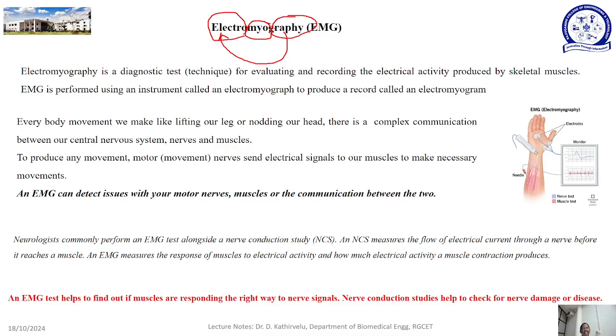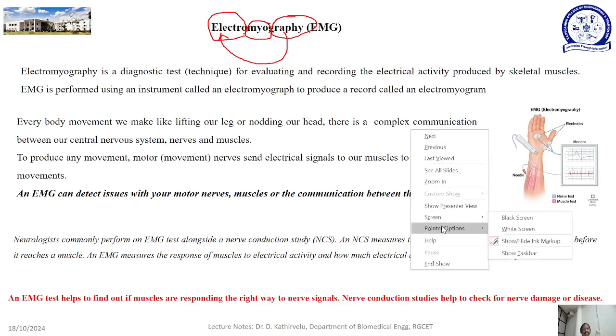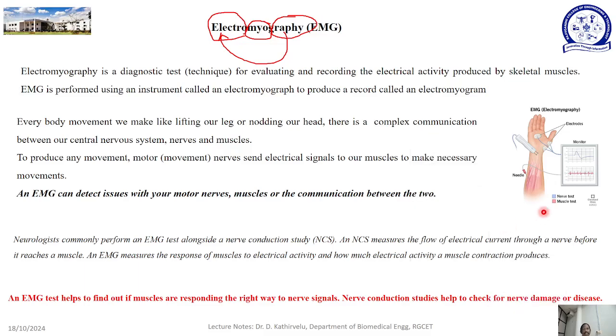The electromyogram is the graphical waveform which we see on this monitor, the myogram. Electromyography is a diagnostic test used to study the electrical activity of skeletal muscles.